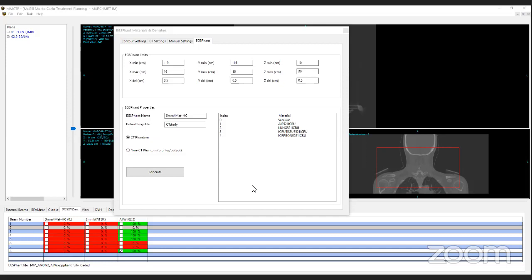Okay. But in a situation like it is now, where the system is retrospective, I can't get access to that if the planner didn't do that. Well, if you open the application and you can get access to the treatment planning system, try to find an option to export, and you can get old plans and export those. By the way, do you have your Linac commissioned in EGS?